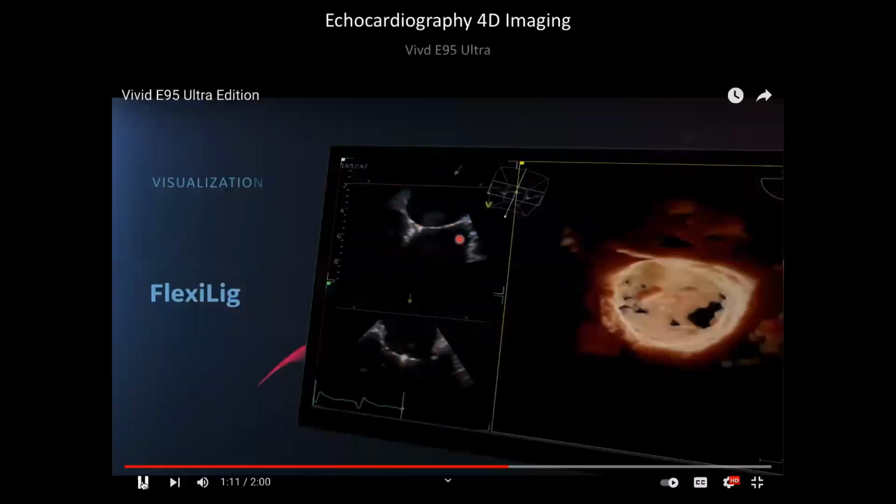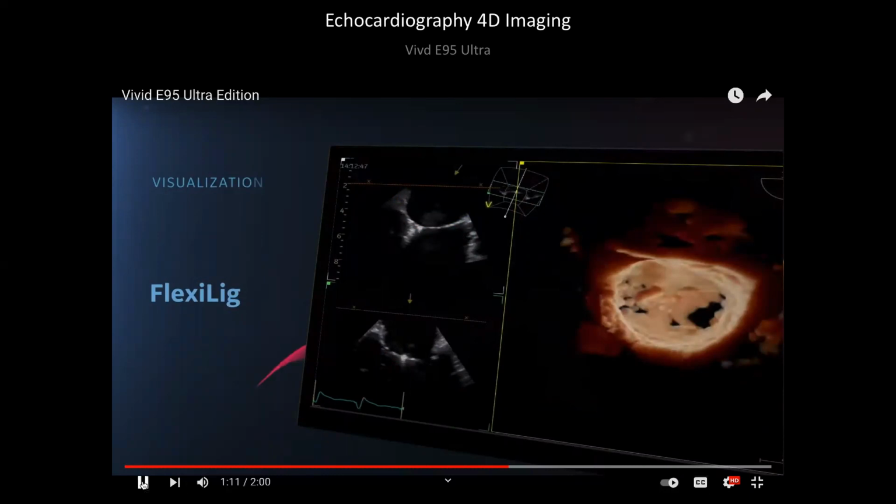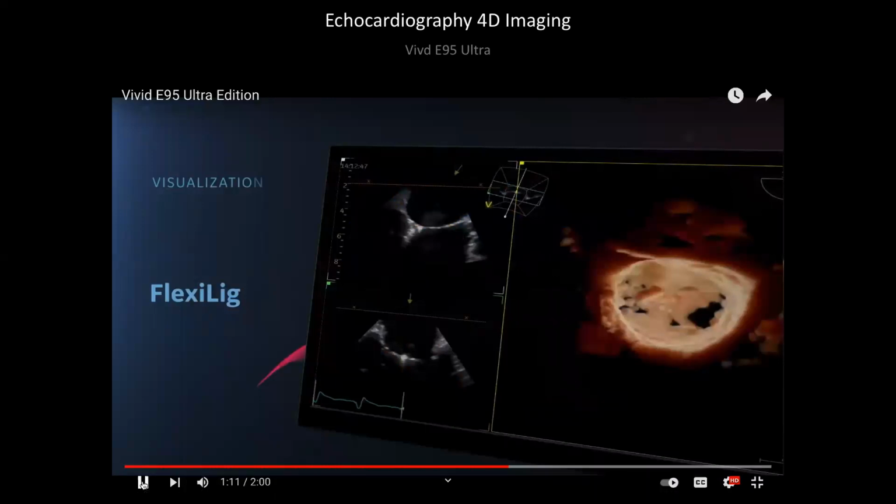Let's go back to Arrow. One of the big things that's occurred in terms of the aesthetics of medical imaging, of 3D medical imaging, is this thing called cinematic volume rendering, where very advanced material composition, reflexivity, and lighting models are used to make something look like a plasticine model.